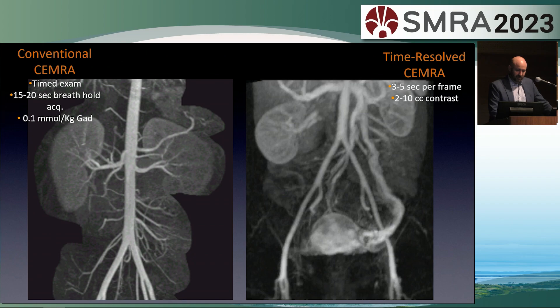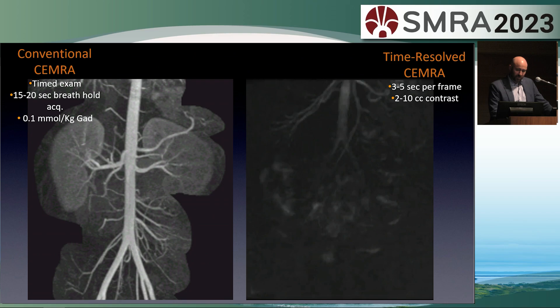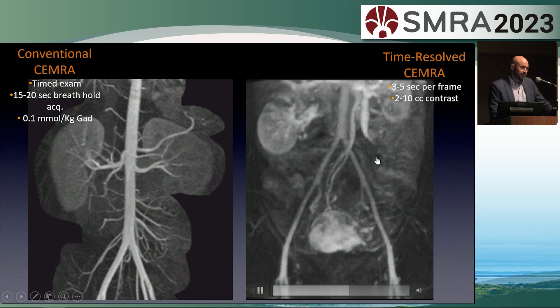The image on the left is a conventional contrast-enhanced MRA exam with a longer breath hold. There's high variability in breath hold length based on acceleration, and you can use varying amounts of contrast based on various factors — this one was obtained with a single dose. The image on the right is a time-resolved MR angiogram in a patient with chronic pelvic pain.